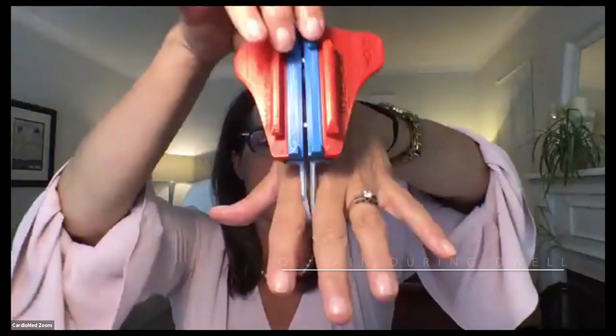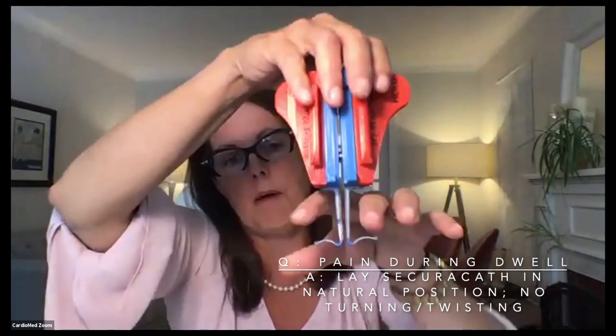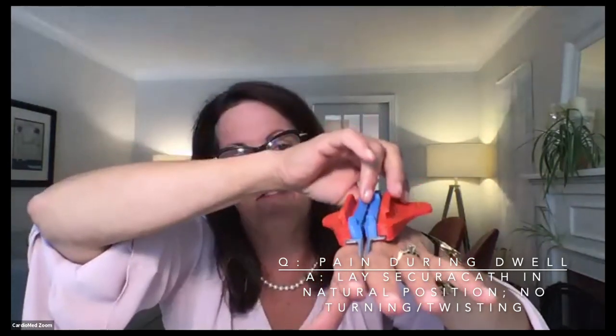And then there was a second patient the same day. And to your point, Michelle, the nurse noticed right away when she took the dressing off. We know that, as you said, the SecurAcath is supposed to just lay flat in its natural position. But she saw as soon as she took the dressing off that the SecurAcath was pushed over to the side. And if you push it to the side, that can twist the feet. So when we're applying it, we always have to make sure we just drop it straight down. And again, as soon as that nurse lifted the device and let it fall into place, that patient said, oh, there's no pain anymore.